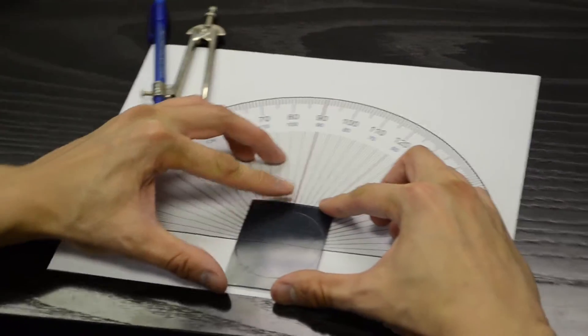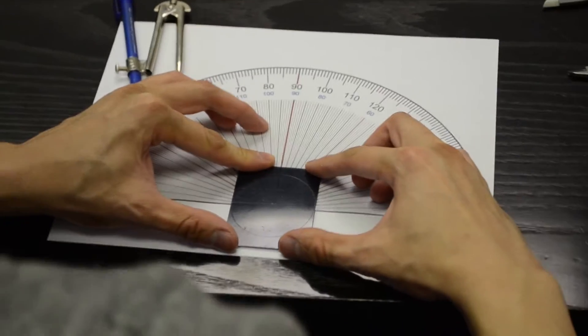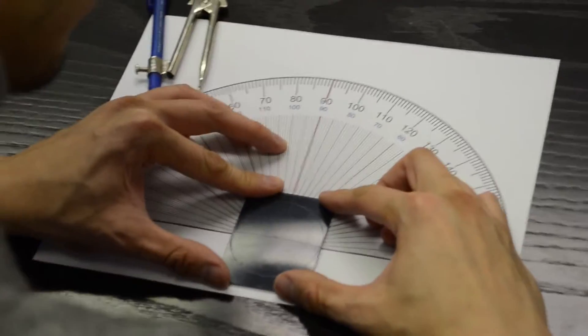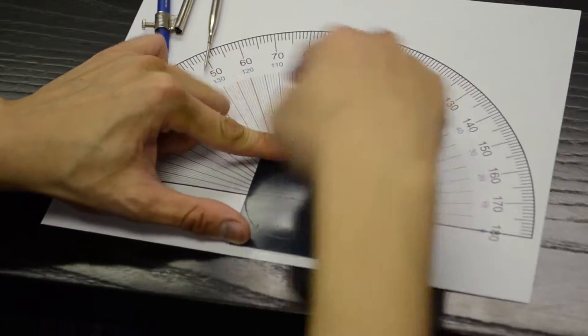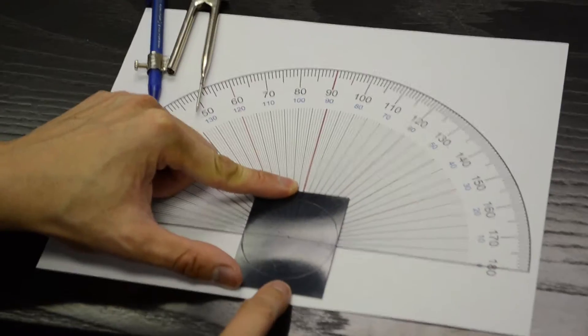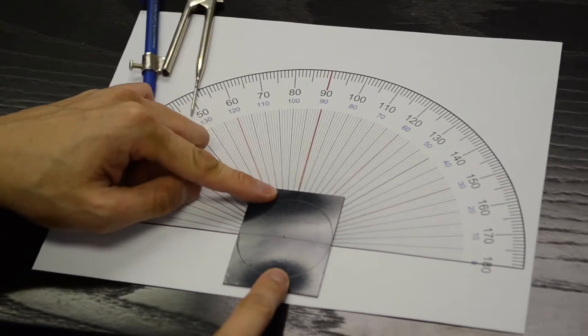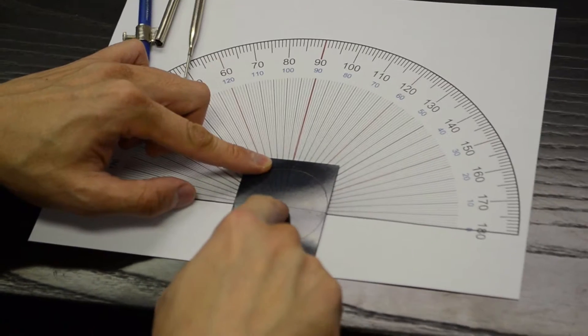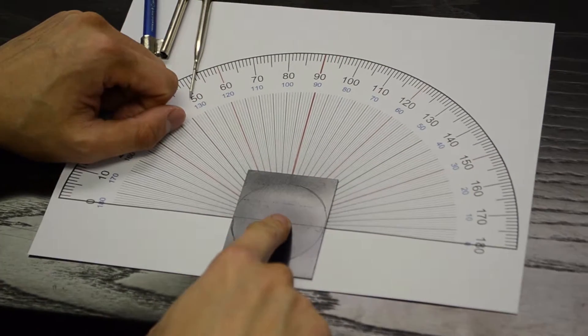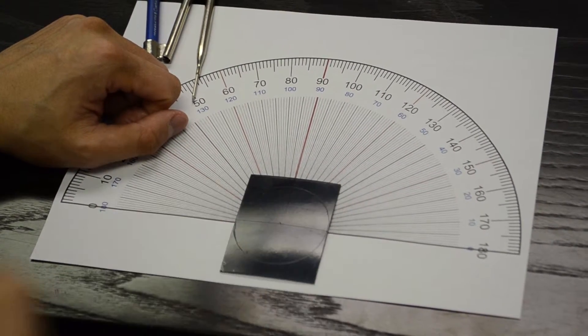From here, what you would do is line up the lens to the actual protractor that we've printed out. Now this lens is actually really nice because I'm actually using a 2 base lens and it's quite thin. So if I press down on it, I can actually get it flat and it's nice and comfortable.